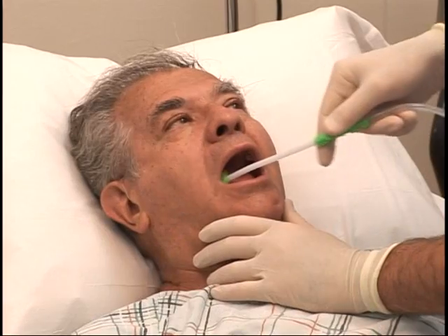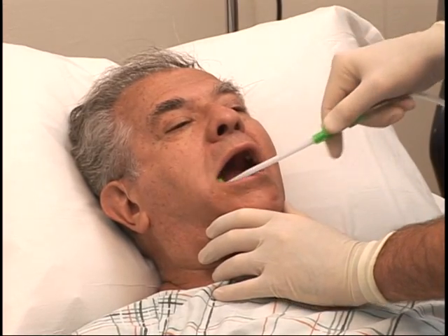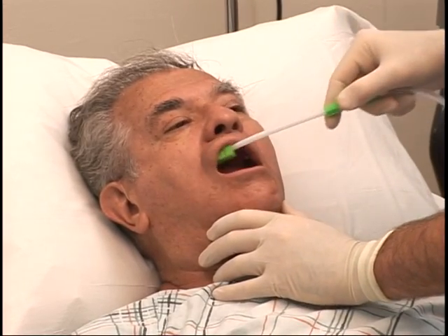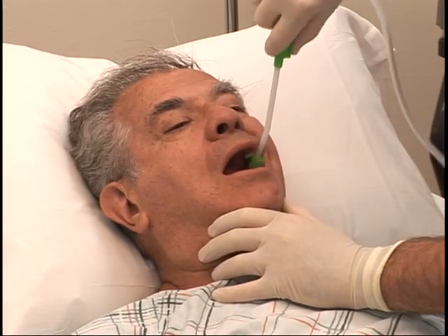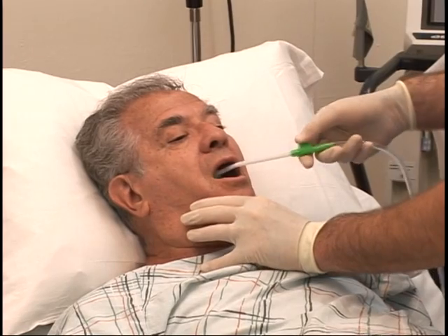Oral care is important because many family members want to kiss their loved ones goodbye. And it's therapeutic for family members to take part in the oral care of their dying loved ones. Oral cleaning and oral suctioning should be easy.